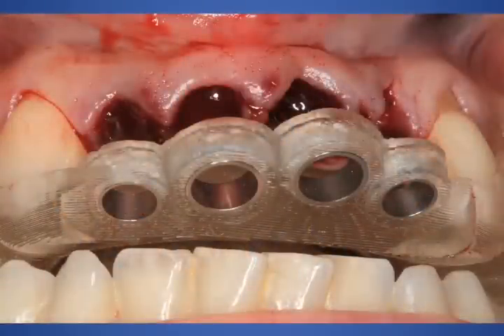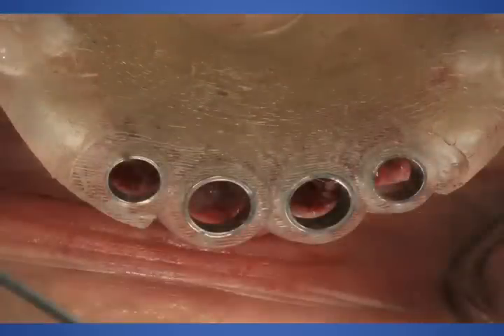Here we're simply placing or snapping in the maxillary surgical guide, again created by the dental laboratory. They've already created models and positioned the final teeth where they ideally need to be. This surgical guide fits on the occlusal of the teeth and needs to be stable. It cannot rock into position, so it's really snug and kind of snaps into position. An occlusal view of the same.